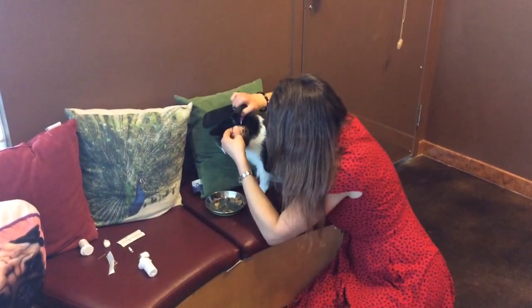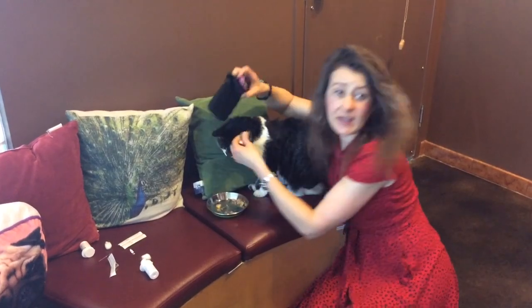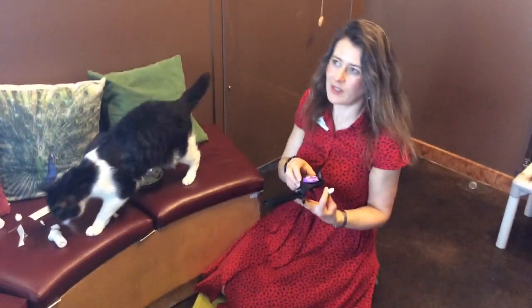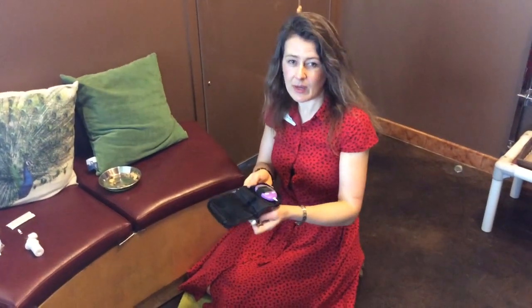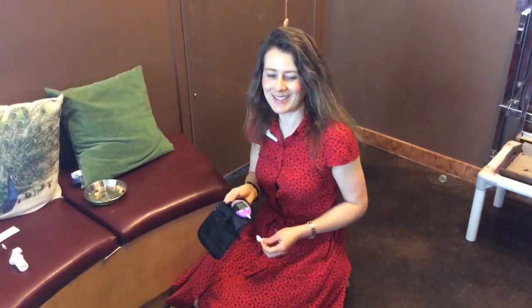There's a nice drop. You have to be kind of fast, but don't be afraid if you have to do this twice — I've done this a thousand times so it becomes quite easy. The reader shows you the reading right in millimoles, which are the Canadian units we always use.